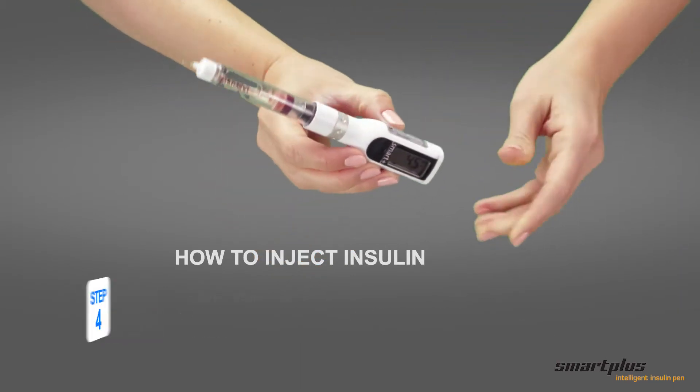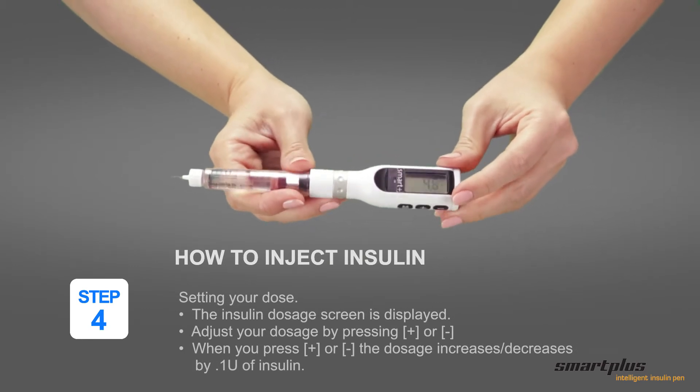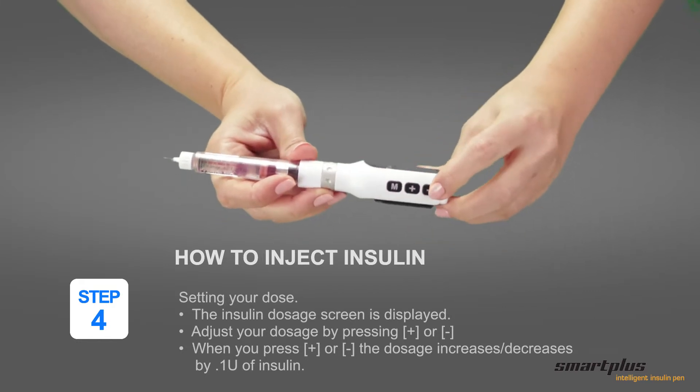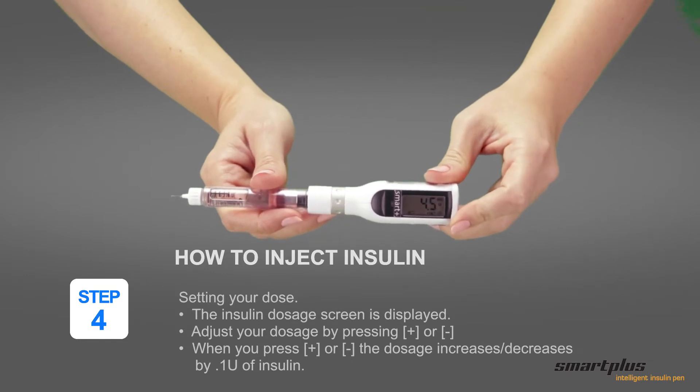Step 4: Setting your dose. The insulin dosage screen is displayed. Adjust your dosage by pressing plus or minus. When you press plus or minus, the dosage increases or decreases by 0.1 of a unit of insulin.